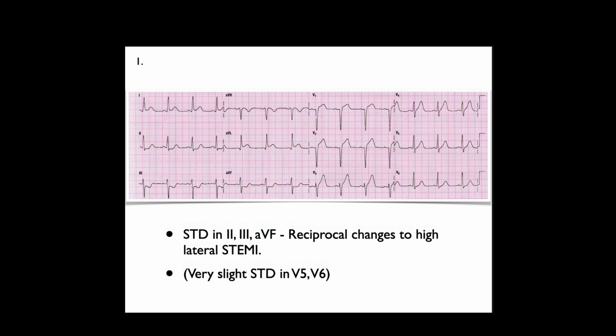Would you call that? Oh, I see what you're saying. You're wondering about the one in AVL. I mean, definitely it's AVL. So in this particular case, I would have no trouble calling this a high lateral STEMI.